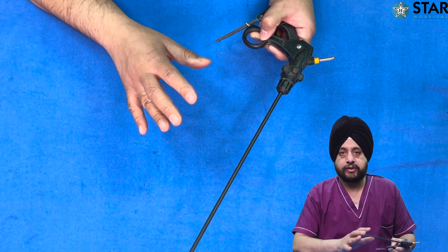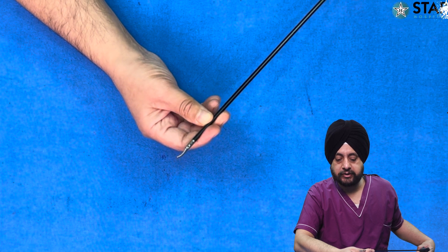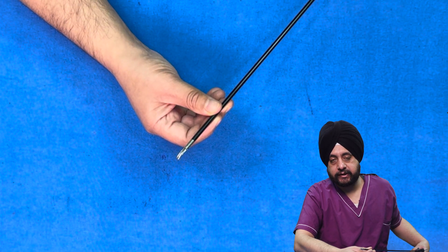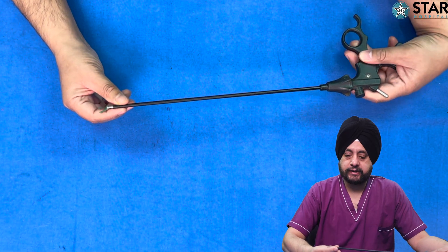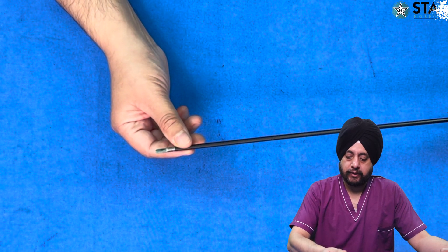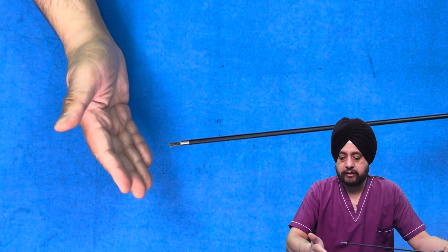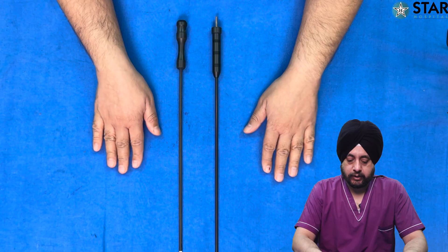This one is a routine laparoscopic scissors — a curved scissor usually used for dissection. You can cut tissues, do dissection, and other things. Even sutures can be cut with scissors, but we also have a hooked scissor especially designed for suture cutting. The hooked scissor has a tip shaped like a hook — you engage your suture and then cut it, preventing slippage. Since the tips are blunt, it also prevents injury to an organ, making it more useful and safe for cutting sutures.